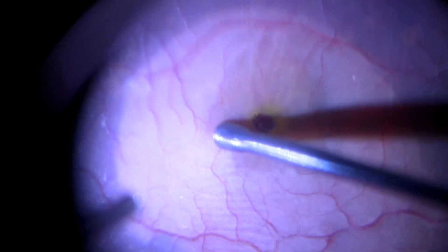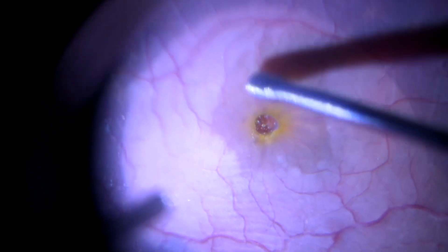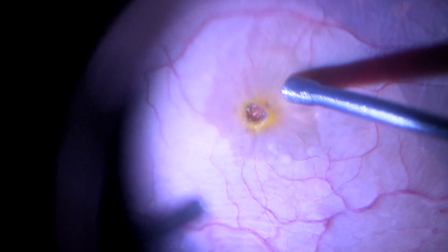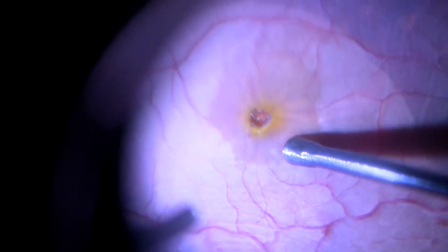At the end of an ILM peel, the massager is used to gently relax the retina around the hole in a circumferential manner. This is atraumatic to the retinal surface as it does not have any rough irregular edges, unlike the forceps.